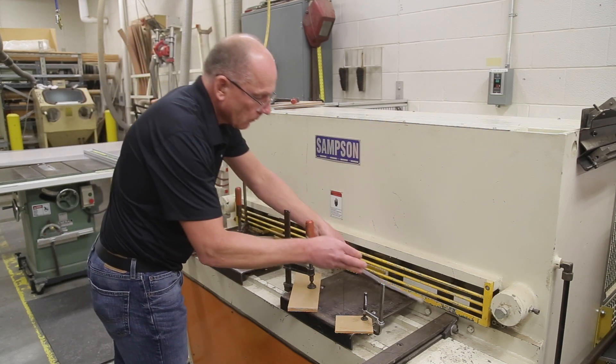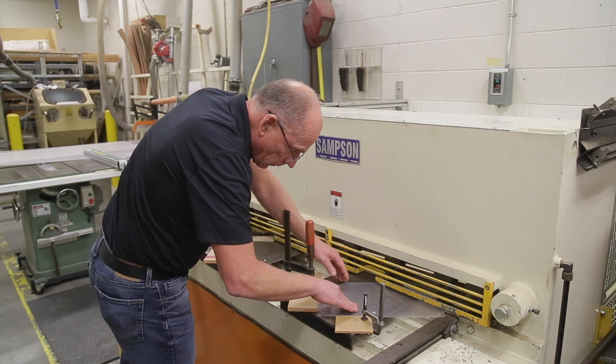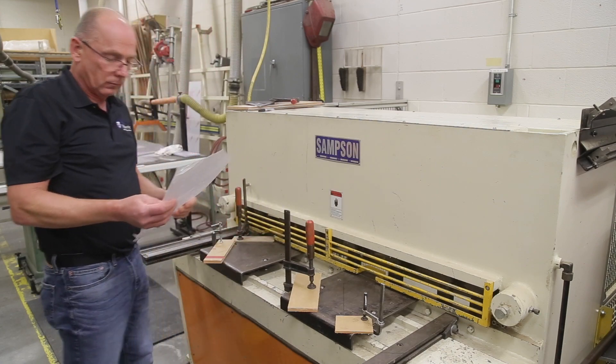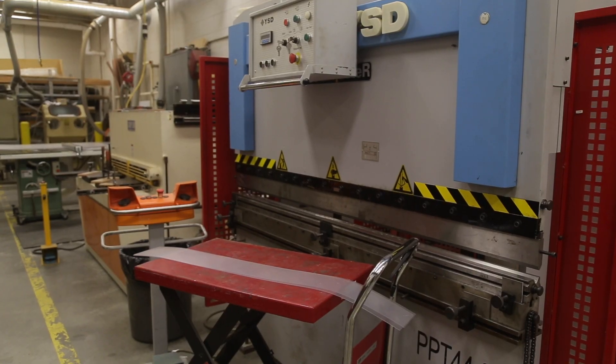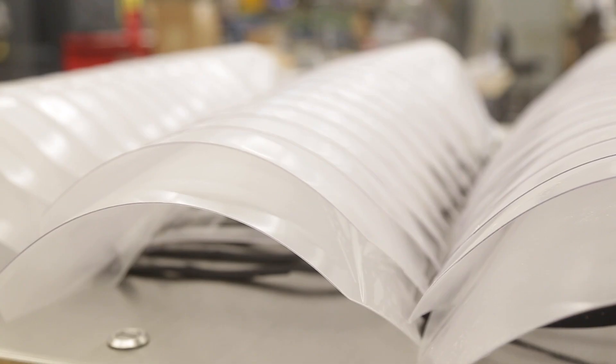We cut them one at a time. We made 200 of these last Thursday in a six-hour day. The crew came in today — four of them — and they ran 50 of them in about two hours.